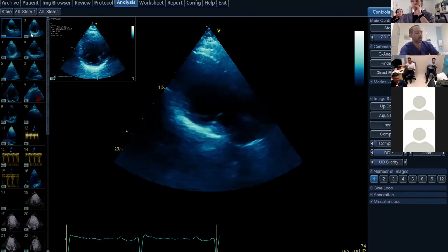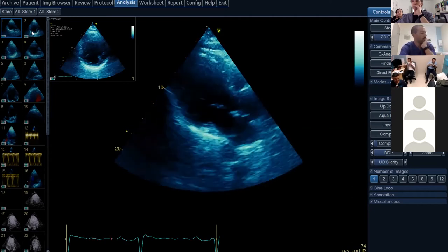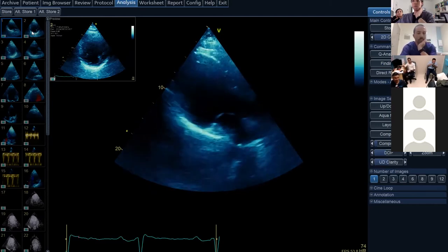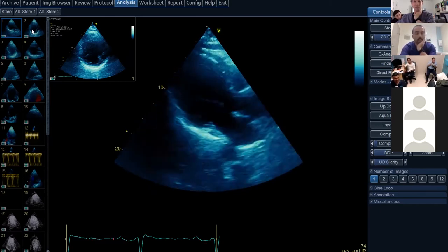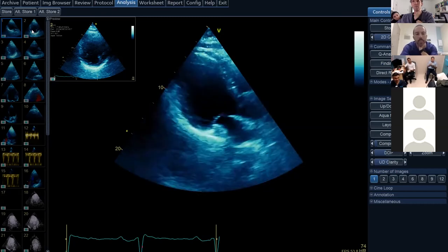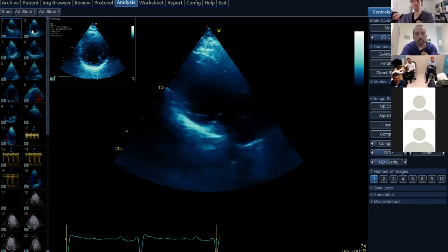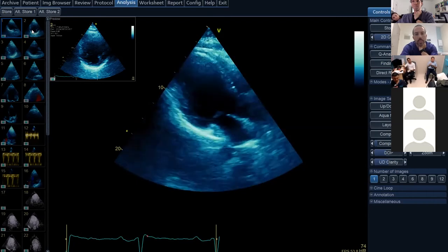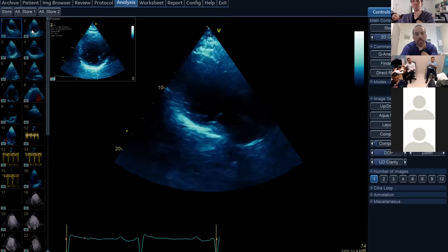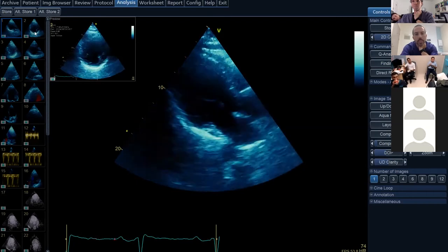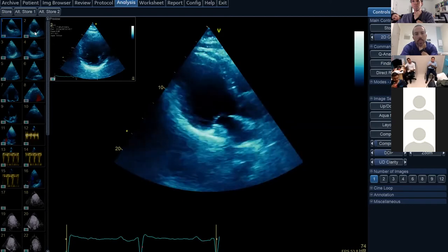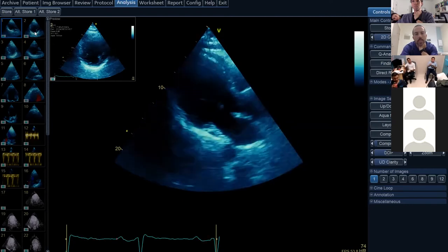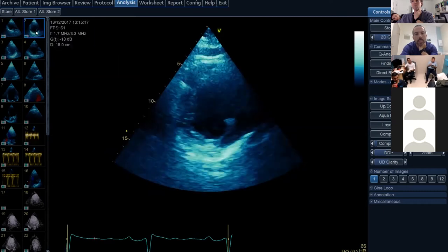In terms of regional wall motion: the anteroseptal basal and mid portions — and a little of the apical region — appear akinetic. There appears to be hypokinesis of the visualized portion of the posterolateral wall.